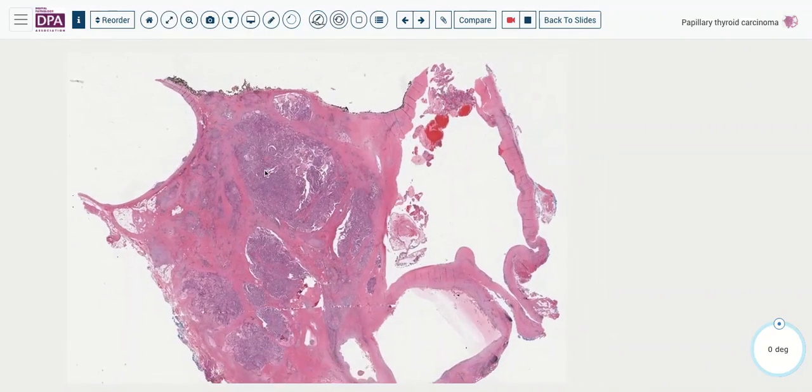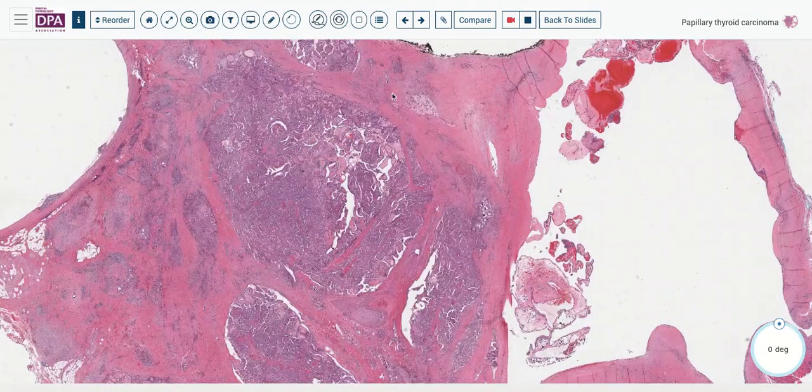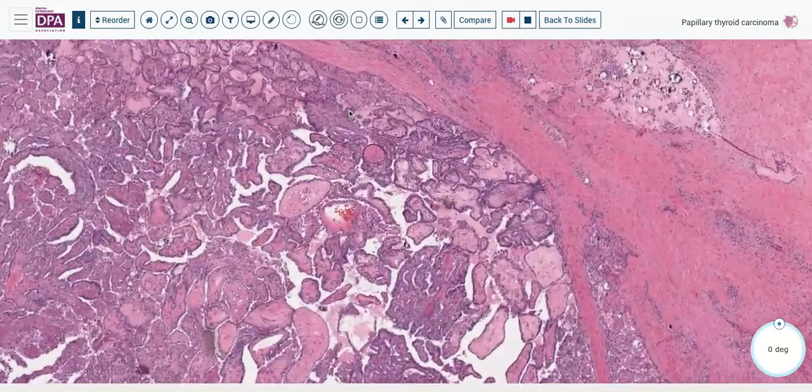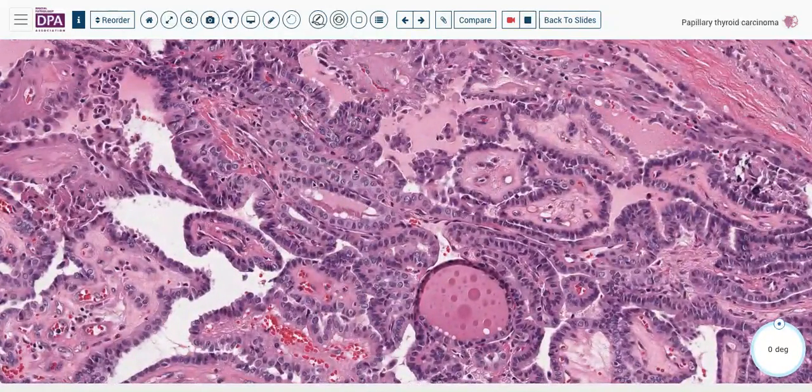And again, you may benefit from coming back and comparing these papillary predominant with the follicular predominant patterns and so forth, so that you get a nice feel for the nuclear atypia, the features that we're looking for in the nuclei that will give us that diagnosis.